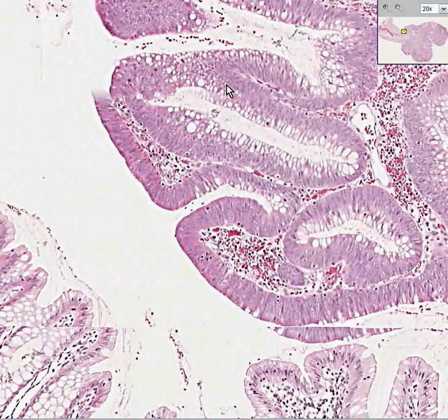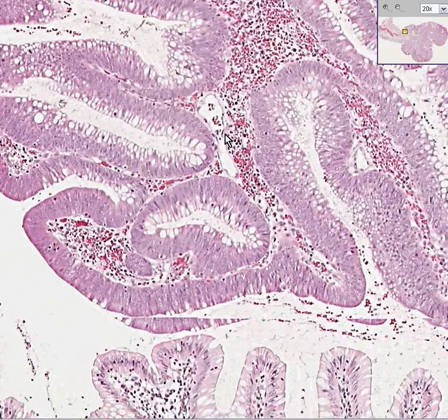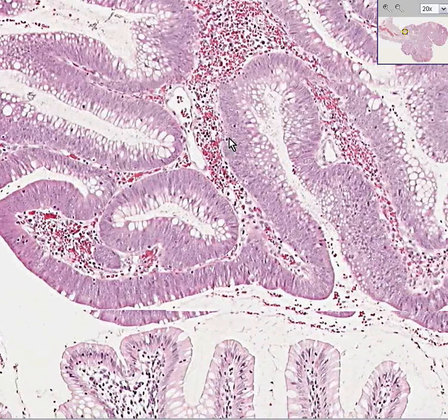When you see areas like this, there's an increased mitotic rate as well. This is an adenomatous polyp. It is not a hyperplastic polyp. Thank you very much.